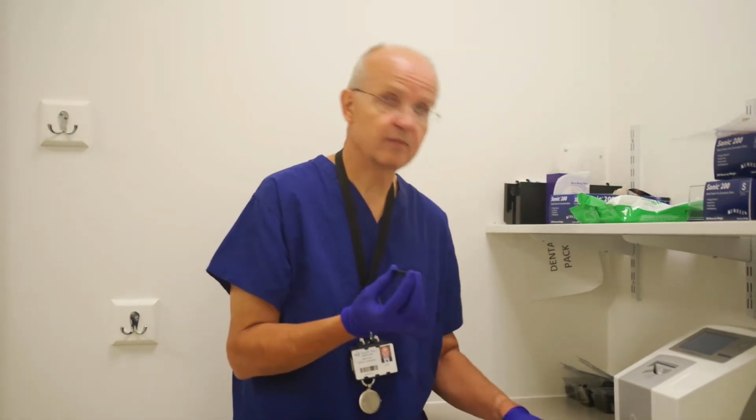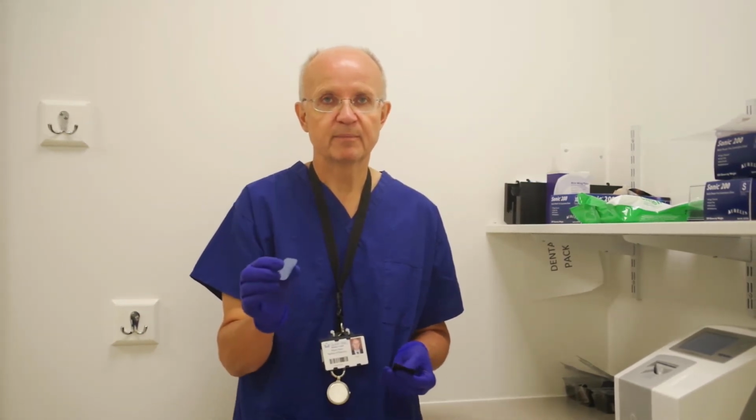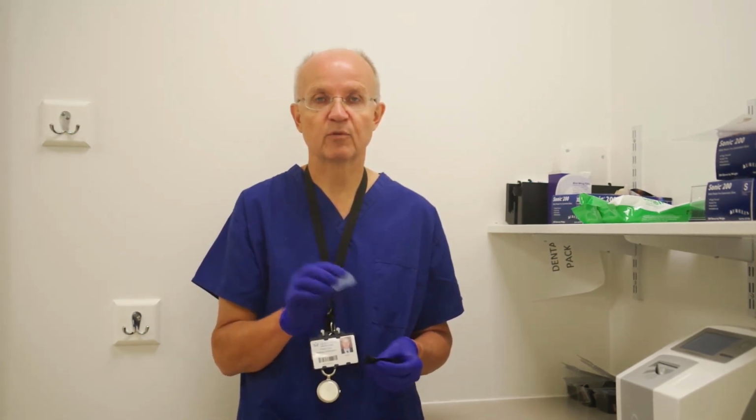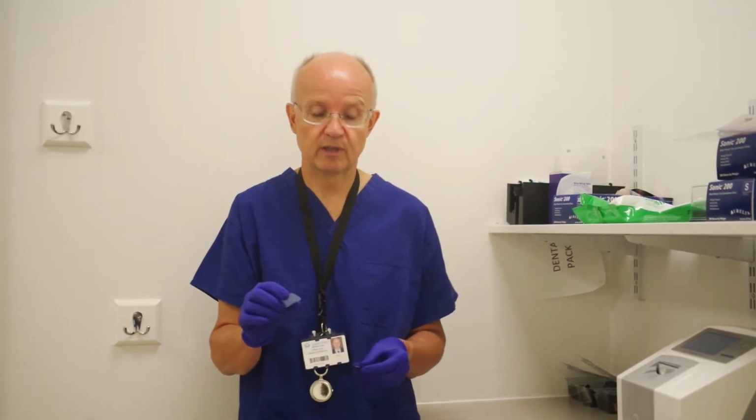Now we don't have to worry about it before we take the X-ray because all the white light will do is just clear any image that's on there. But once we have placed it in the patient's mouth and exposed it to radiation, it will have that latent image on there. What we don't want to do is to expose it to light at that point before we've processed it, otherwise our image gets wiped out.